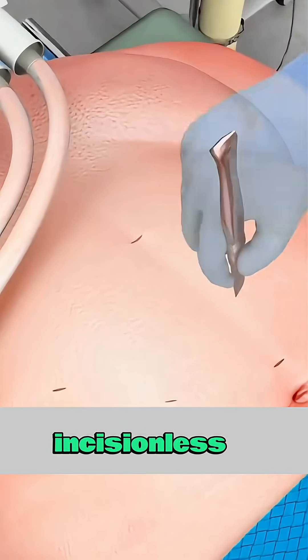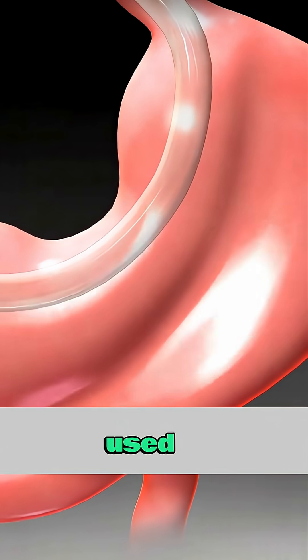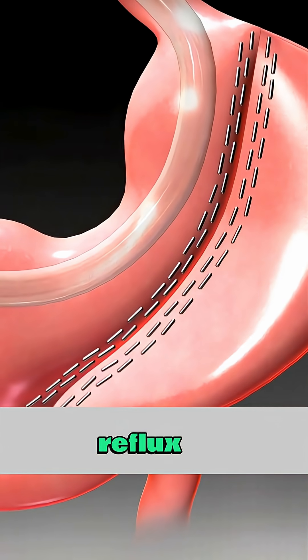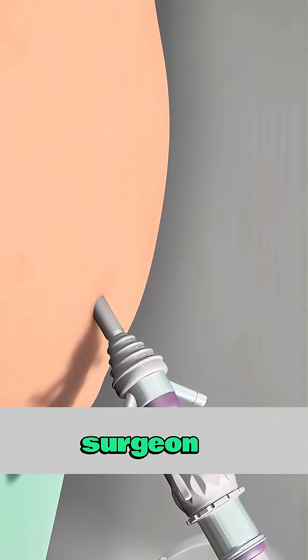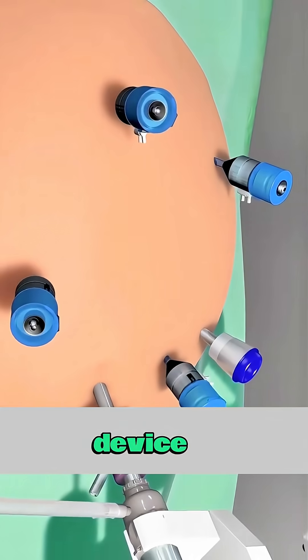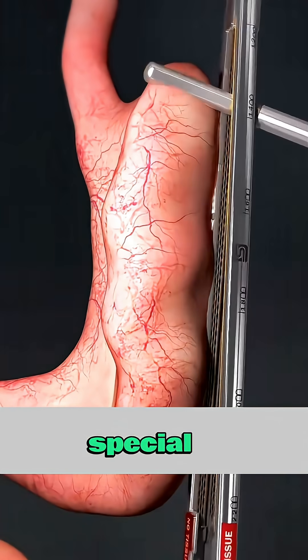Ever wondered how transoral incisionless fundoplication is performed? It's a minimally invasive procedure used to treat chronic acid reflux without any external cuts. The patient is put under general anesthesia, and the surgeon inserts a flexible device through the mouth and down into the esophagus using this special tool.